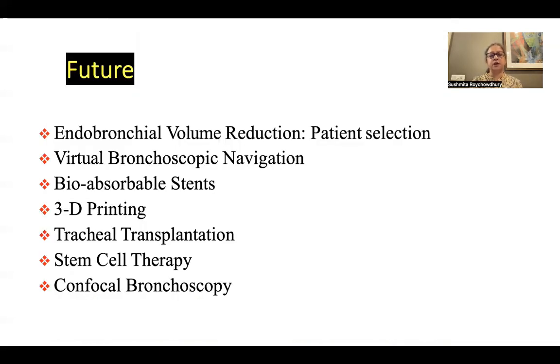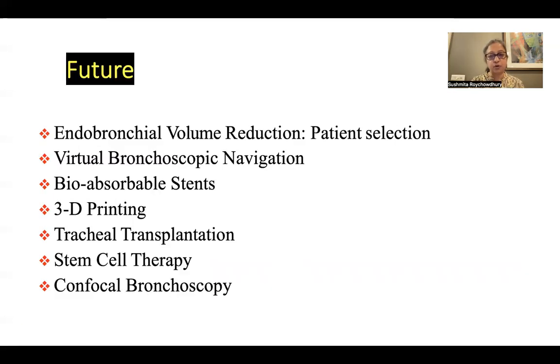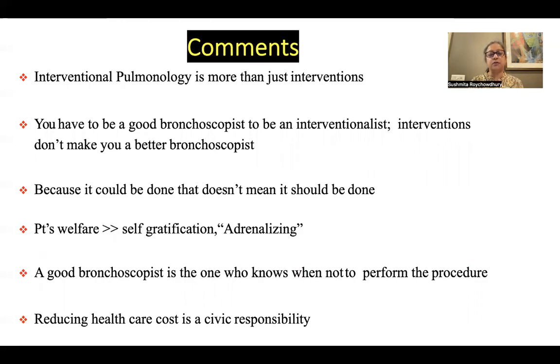The future has lots, including bioabsorbable stents, 3D printing of the lesion to customize the size of the stents that are needed, tracheal transplantation, stem cell therapy, and confocal bronchoscopy. I could go on and on, but this was just a taster to tell you that interventional bronchoscopy, or interventional pulmonology, has gained by leaps and bounds.